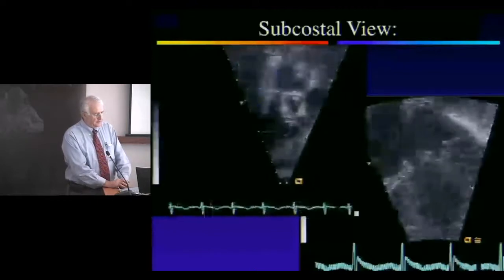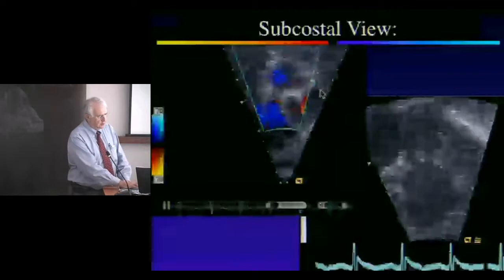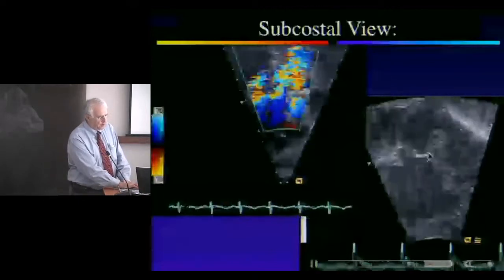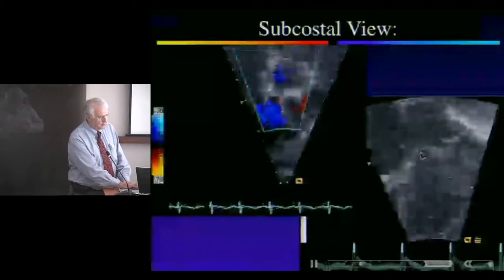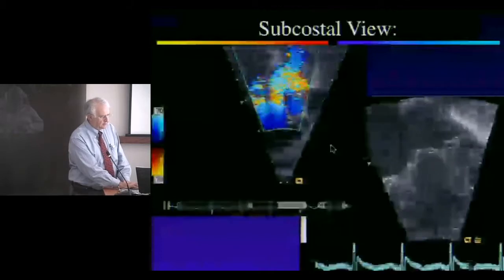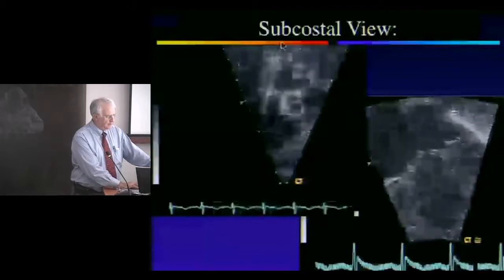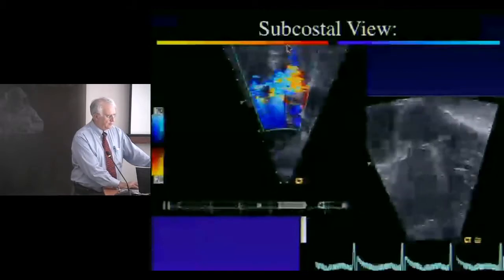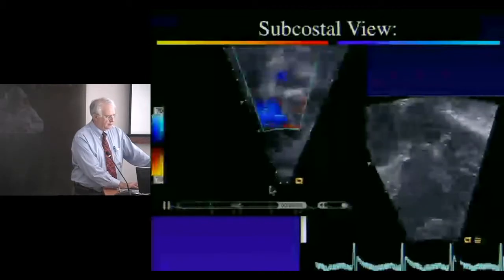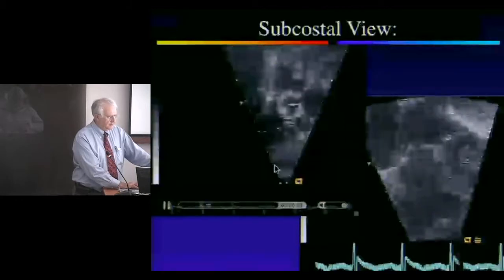So echocardiographically, we look at many things about the valve. Certainly in children, the subcostal or subxiphoid approach is the best approach. You can see here sort of doming of the valve leaflets with thickening of the leaflet tips, and this valve doesn't separate like a normal valve, but remains as a dome. It's an excellent way to interrogate the heart by continuous wave Doppler, because the flow velocity is absolutely better aligned in this projection than many others.